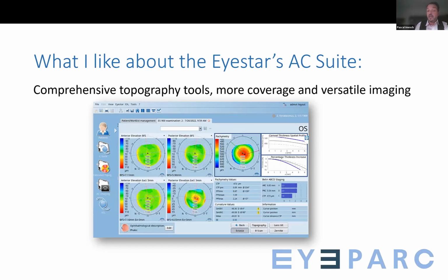Additionally, you can examine the keratoconus probability with this program. It puts a best fit sphere on the cornea, and you can have a best fit sphere with or without a 3 mm central exclusion zone, which helps you very much to show if this cornea fits into a sphere or not and may have a beginning conus.